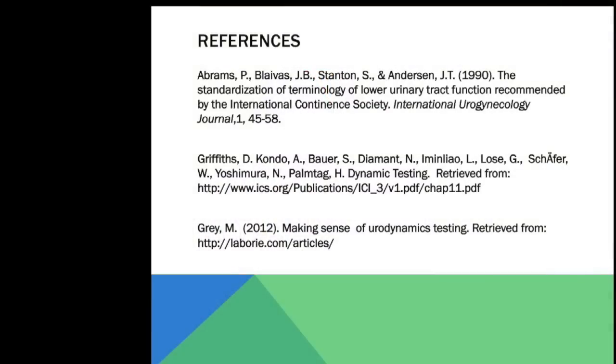But if you see a spasm on your graphic and you're not seeing any leaking happening, then you're worried about reflux. More often than not, you're trying to protect the kidneys on these people, the renal function. But again, I won't go over 1,000 mLs. What more do you really need? Most of these people have catheters in or are straight cathing, depending on their situation. So, yeah, that's what I hope for. Thank you.